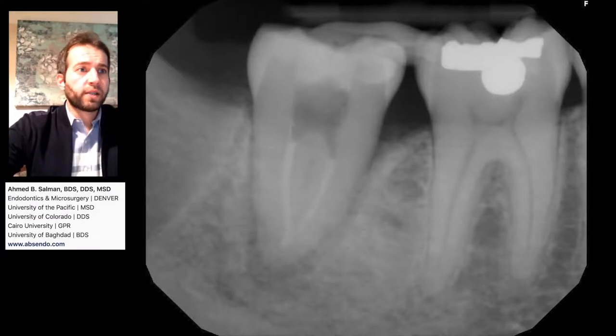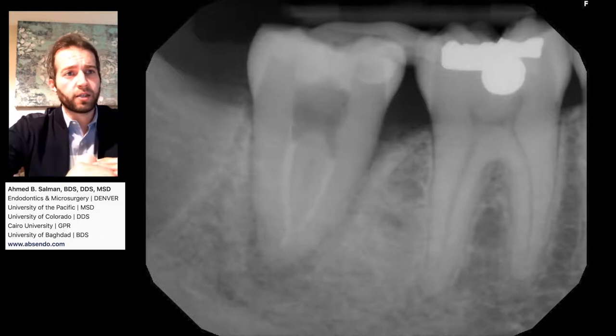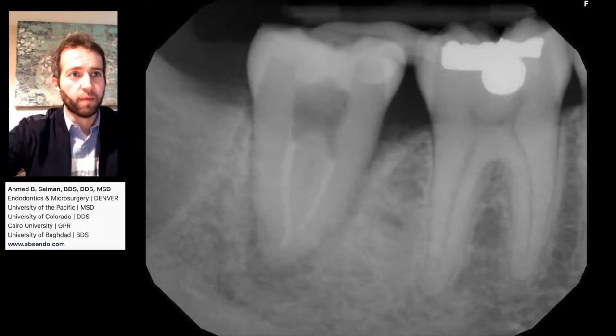All right, so this is the second appointment. We have the patient come back in three weeks. In transplant cases, you usually give the patient about two to four weeks to let the calcium hydroxide sit in. It also gives more time for that tooth to be splinted for better stability. The patient is back, totally asymptomatic, they're feeling fine.